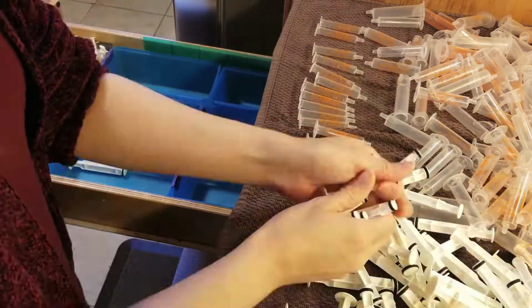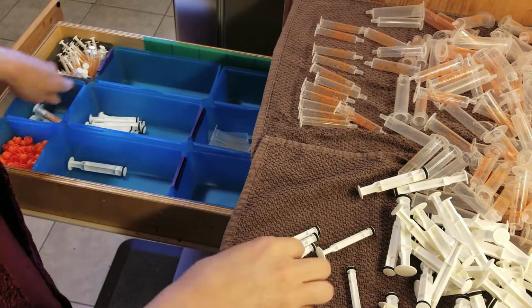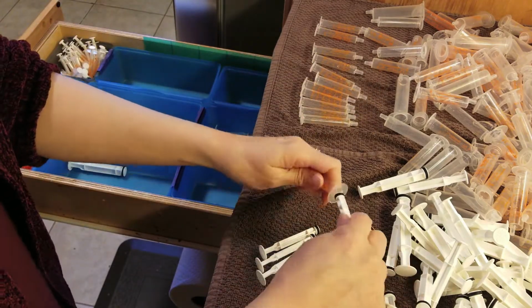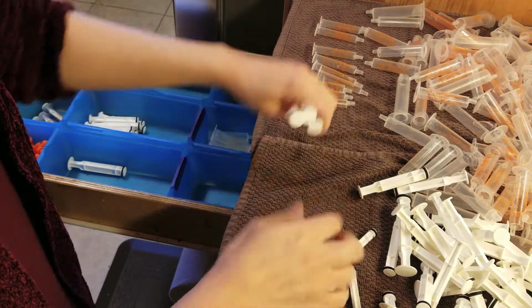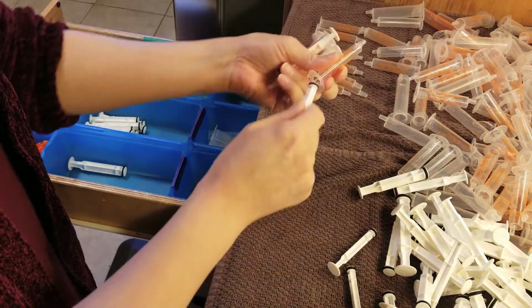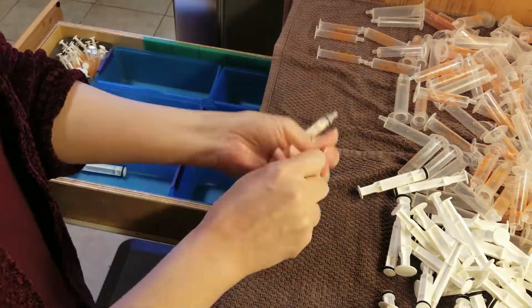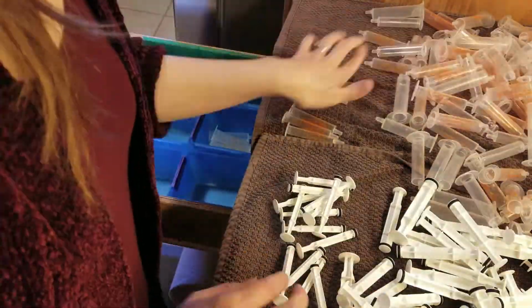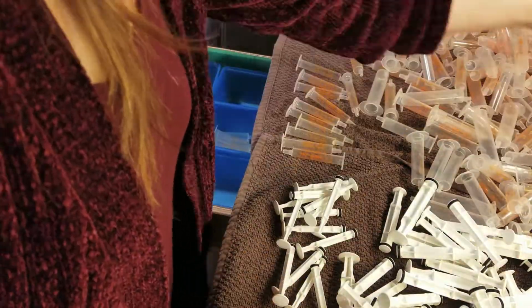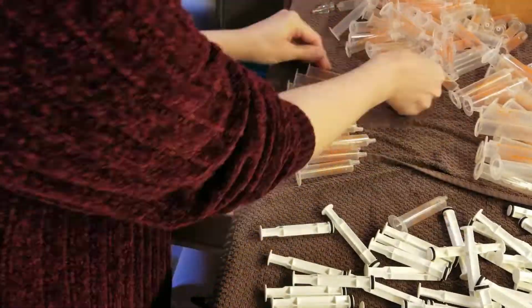I will also put the plungers back into the barrels for the medications that I draw by liquid form. For medications that I prep using pills, there's no point putting the plunger back. That's just an extra step because I'll have to pull the plunger out in order to draw the pills. And for Hezi, everything goes through his G-tube, so pills have to be dissolved in water. So we'll put the pills into the syringe and then we'll pull some water and shake it and wait for the pills to dissolve.